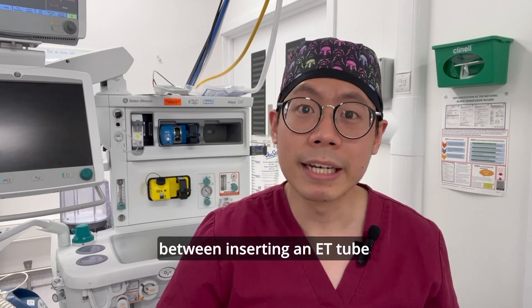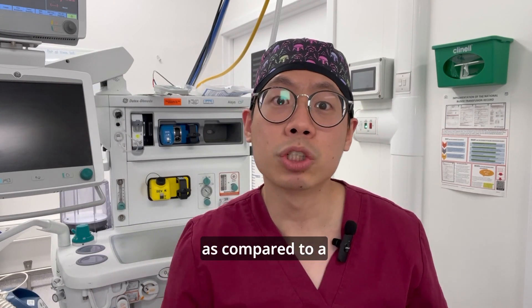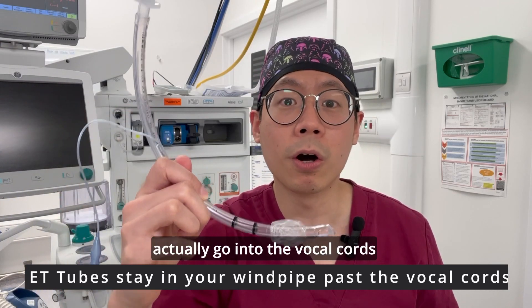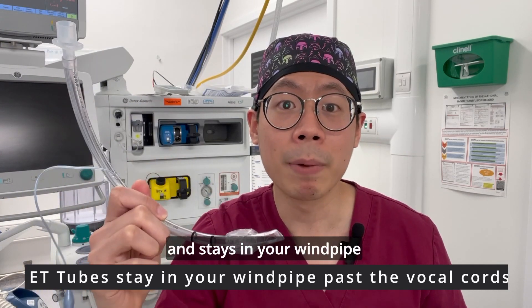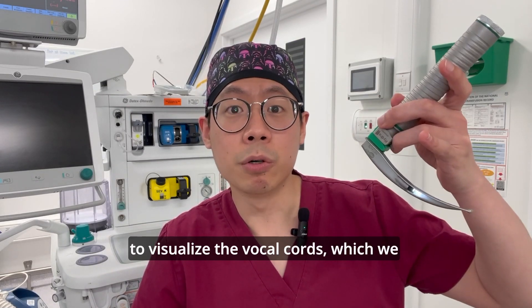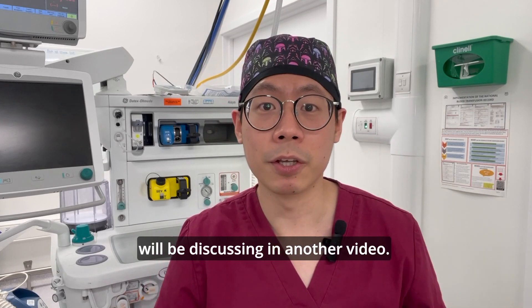The difference between inserting an ET tube as compared to a supraglottic airway device is that these tubes actually go into the vocal cords and stay in the windpipe, with the help of laryngoscopy to visualize the vocal cords — which we will be discussing in another video.